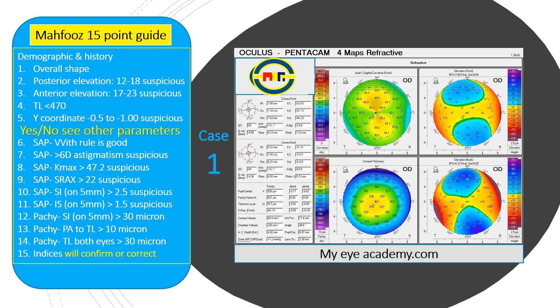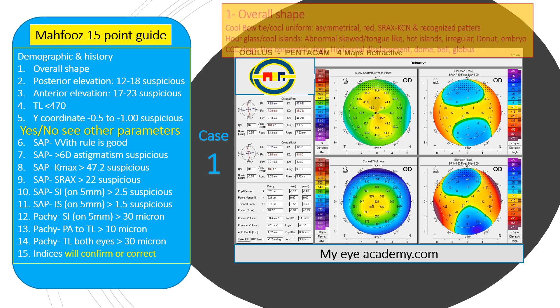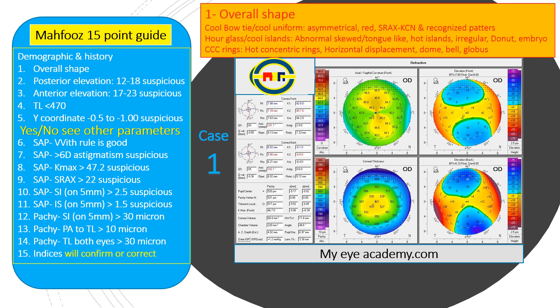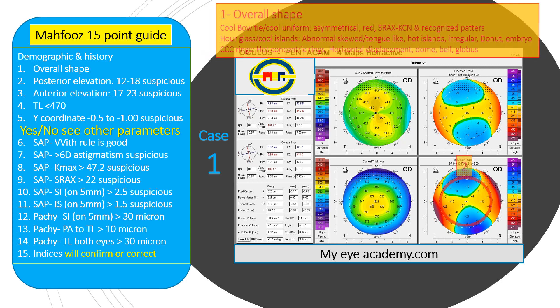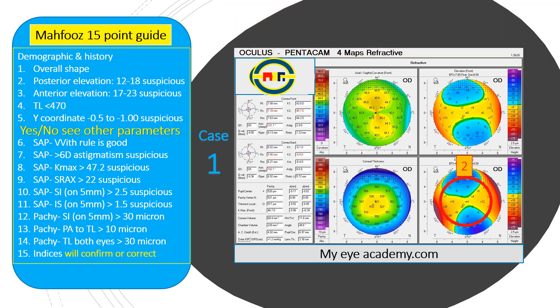We start with case number one. The overall shape is a cool bow tie on the sagittal map, cool islands on the elevation map, and central cool concentric rings on the pachymetry map — all of them are normal patterns. Number two is the posterior elevation: it is less than 12 in all areas, so it is again normal.